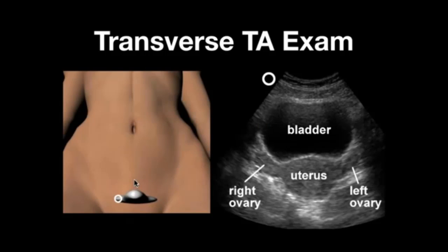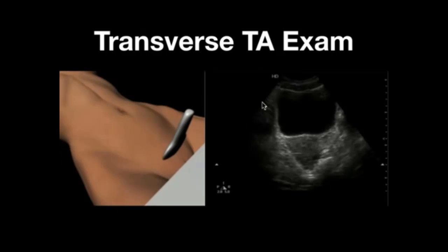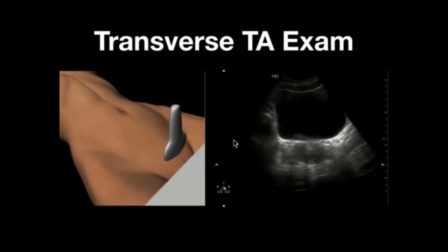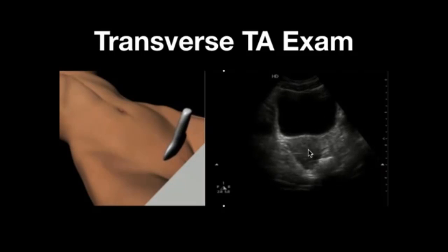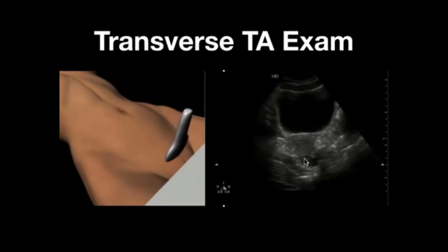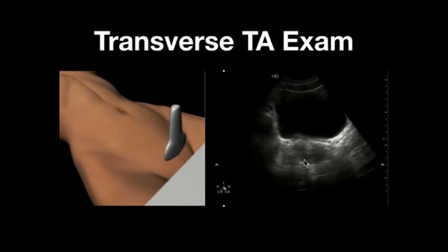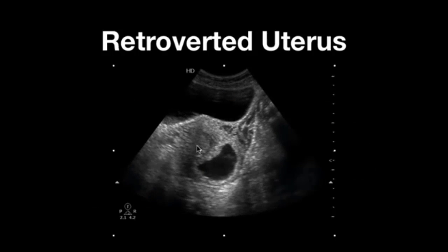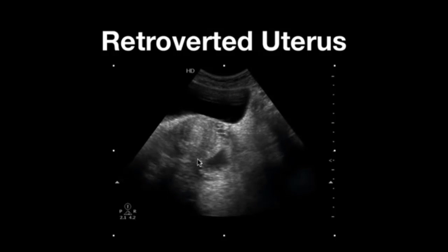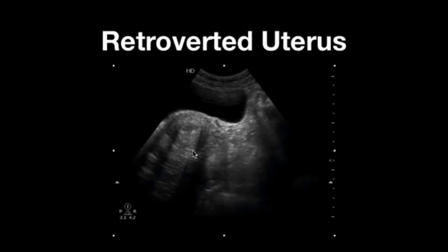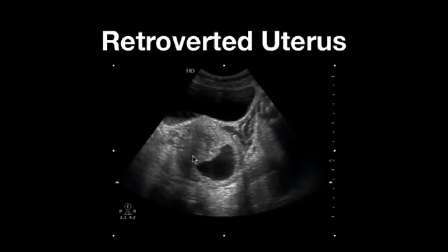For the transabdominal transverse exam, place the indicator toward the patient's right, just cephalad to the pubic symphysis. This provides an anterior-posterior, right-left orientation. The urinary bladder is anterior, and you get a short-axis view of the uterus with the cul-de-sac posteriorly. Angle the transducer in a caudal then cephalad direction, sweeping from the cervical region all the way up to the uterine fundus to fully assess the uterus — including in the patient with a retroverted uterus.